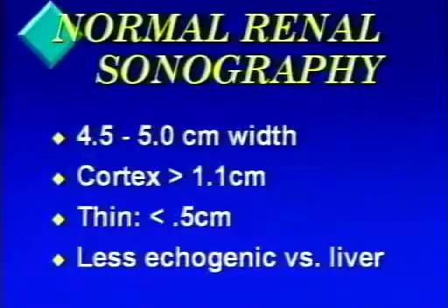Now, when an exam is requested for a renal artery stenosis evaluation, it is important that you include a normal renal sonography examination to evaluate the size, shape, echogenicity, and any abnormalities of the kidney. And a bilateral examination should be performed, and if any abnormalities are seen, this should be taken into consideration when evaluating waveform characteristics and the quantitative criteria.